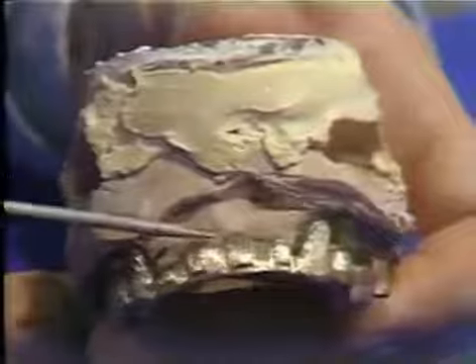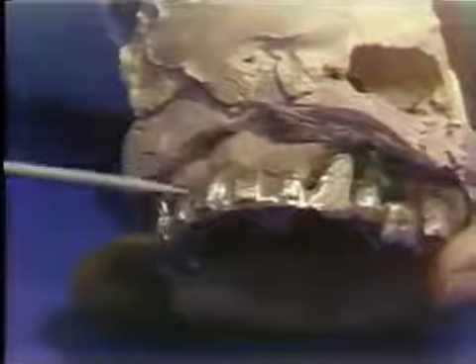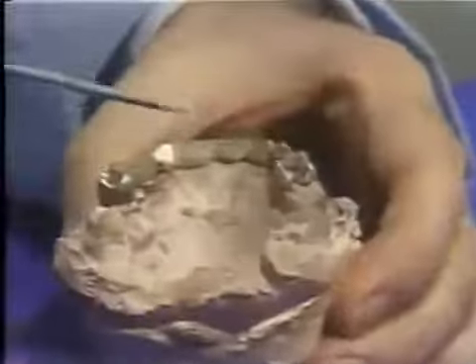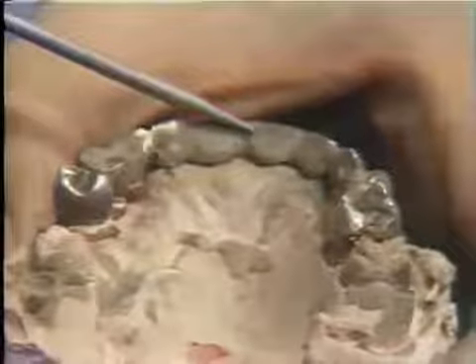Notice that this casting has not yet been finished, and what has to be done here is that the embrasures here and here have to be cut into with a carborundum disc and opened to give the necessary opening for cleansing and so on in that region. I'll just turn it over and you can see the lingual surface which is being developed here. The porcelain, of course, comes up, forms an incisal edge, and then just comes down onto this lingual surface and finishes with a tapered edge in that situation.